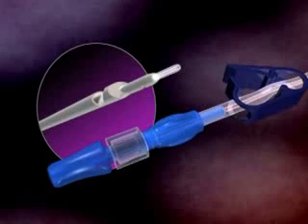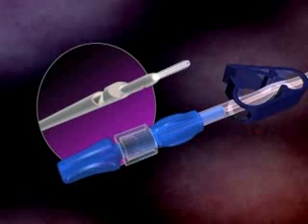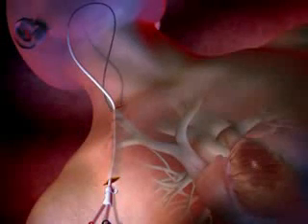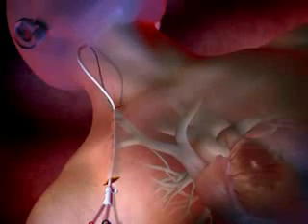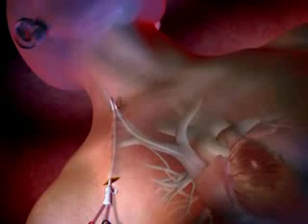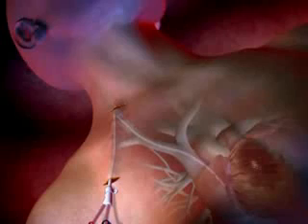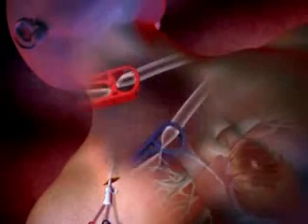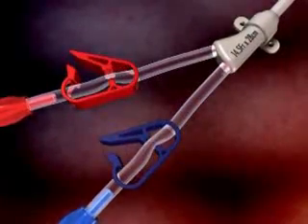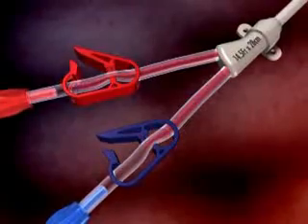Tighten the luer lock of the stylet to the proximal end of the venous lumen. Flush the stylet with saline. Thread the distal end of the stylet over the guide wire tip and advance the catheter into the target vein until the catheter is correctly positioned. Remove the stylet and guide wire from the venous lumen.